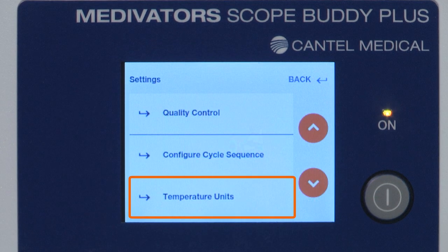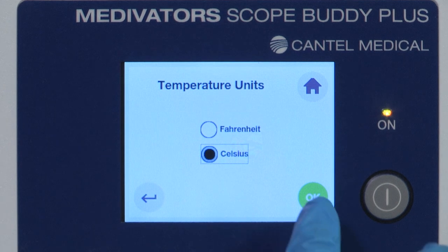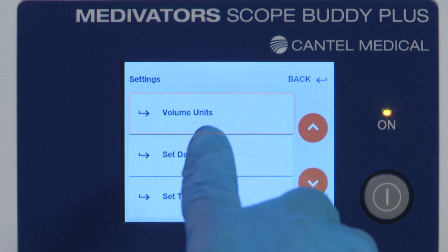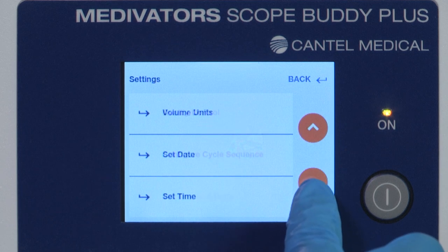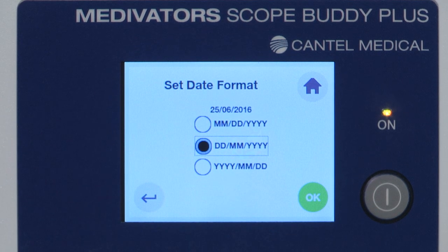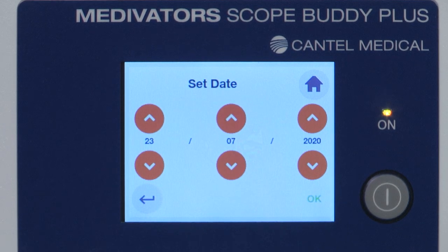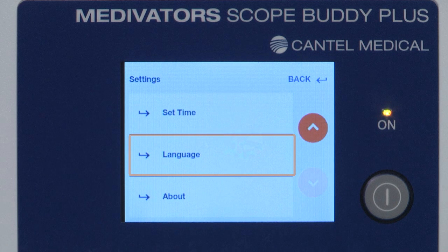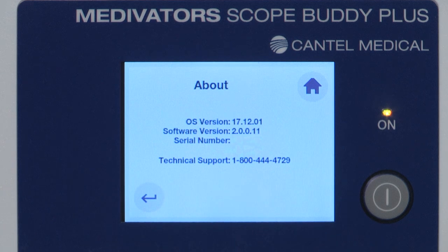The Set Date and Set Time sections adjust the desired date and time format using the option buttons, and adjust the current date and time using the up and down arrows; press OK to confirm. The Language section allows the user to change the user interface language if applicable. The About menu displays information about the device, including hardware, software, serial number, and technical support phone number.